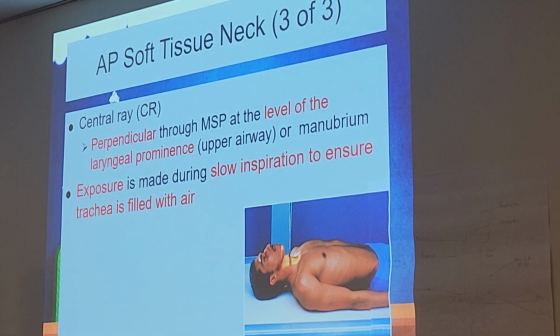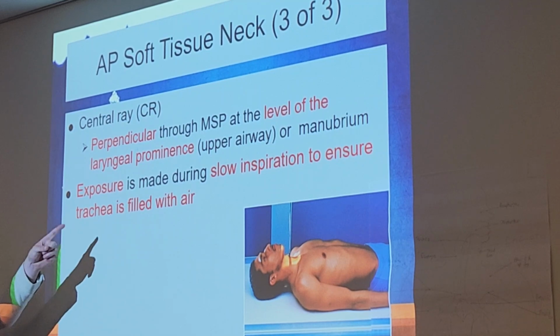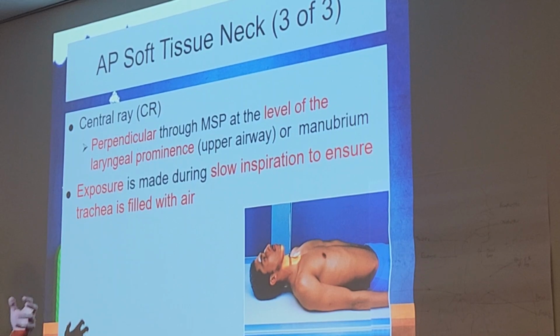Now, exposure, breathing technique, big thing to remember, because you gotta think about what's the star of my show? My air-filled trachea. If I'm not breathing in, am I gonna see air-filled trachea? I am not. But we're in danger because we can still miss it with breathing in. Because if I just take a big deep breath and hold it, am I gonna see air-filled trachea? I am not. When do we take the exposure? During slow inspiration to ensure trachea is filled with air.